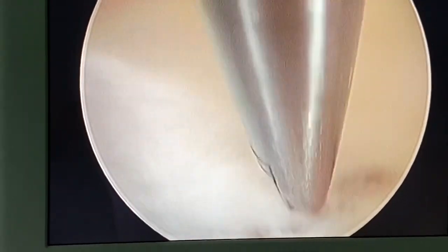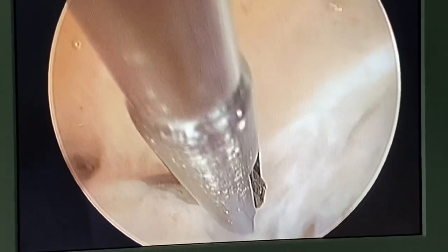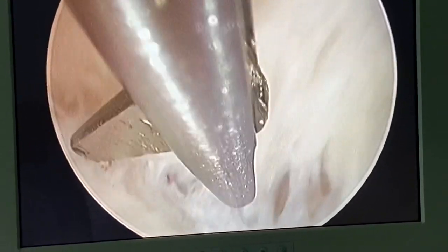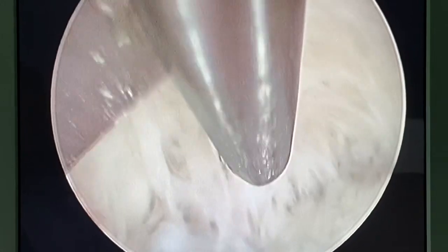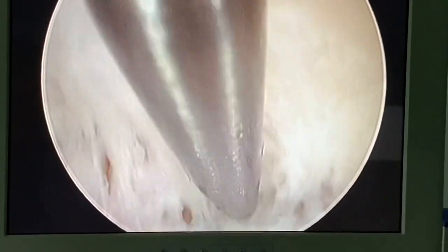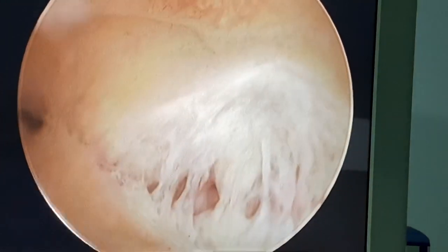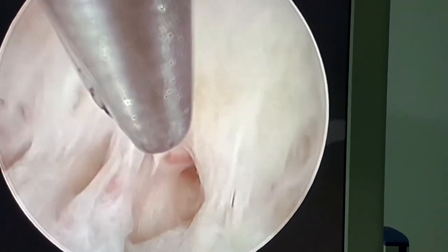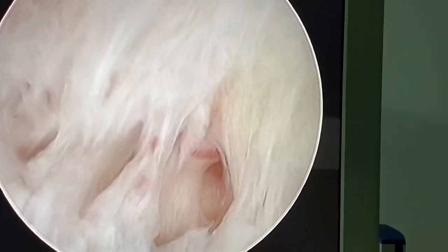I feel comfortable asking my nurse Iman whether I should cut more. She has assisted me thousands of times, so she knows when I work well or not and can guide me. I don't think we should do more — this is a blood vessel. Do you see the blood vessel? Do you see the pulsation?